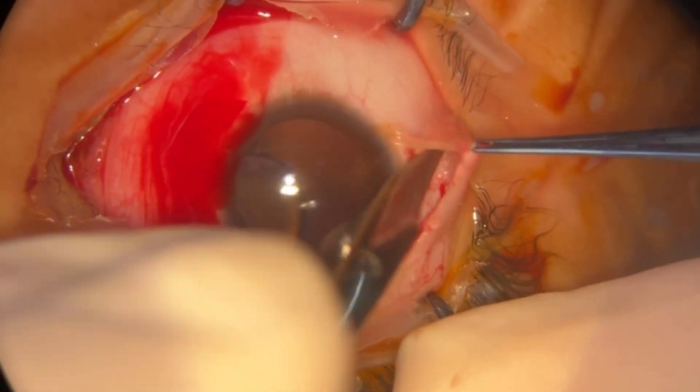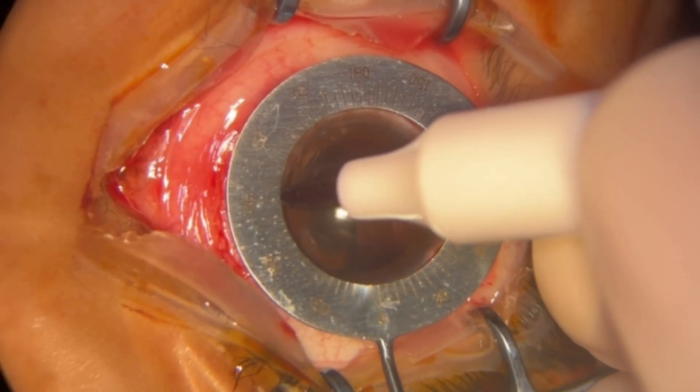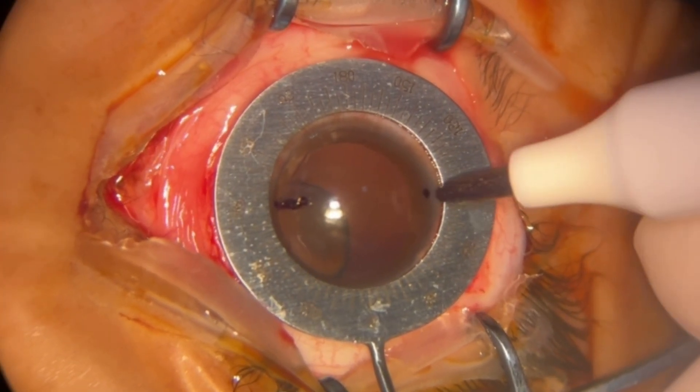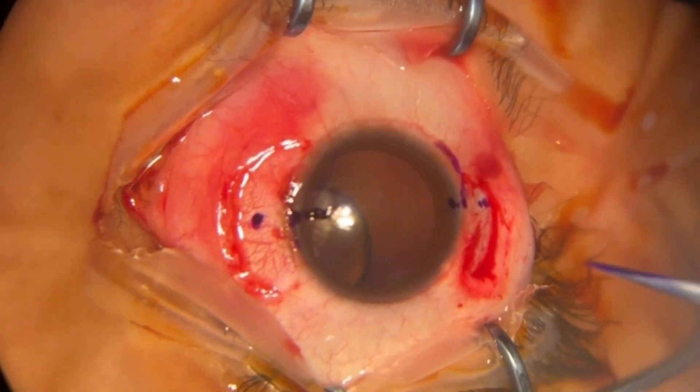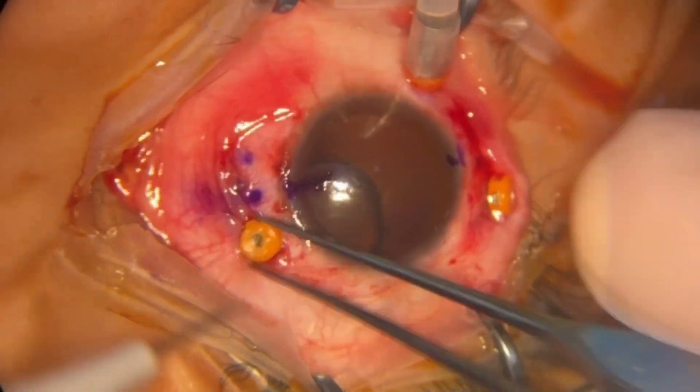The procedure begins by opening the conjunctiva bilaterally. Corneal marking is done at 0 and 180 degrees, followed by a marking 2.5 mm from the limbus and 2 mm from the sclerotomies.